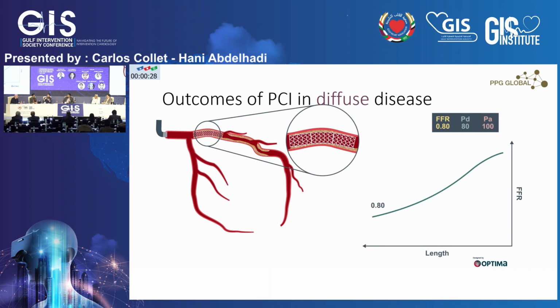Of course, now you have drug coating balloons, that might be an option. We know that long stenting with metallic stents perhaps is not the best solution, but I think today medical therapy looks like a reasonable first selection for treatment in these patients. So let me ask you something on that.